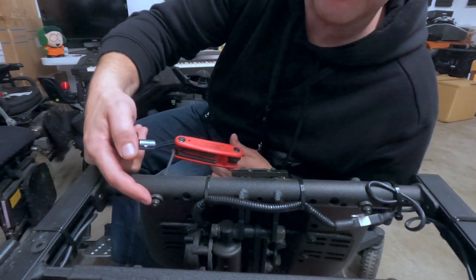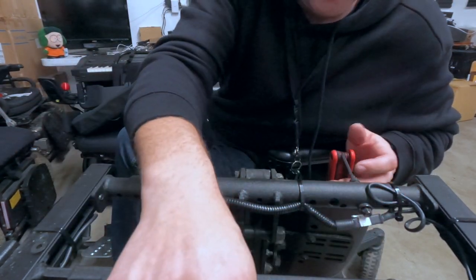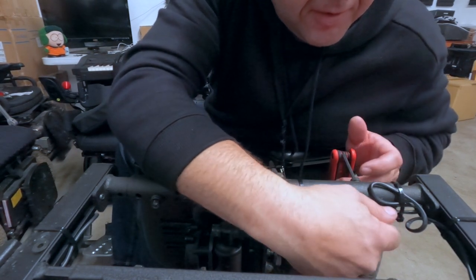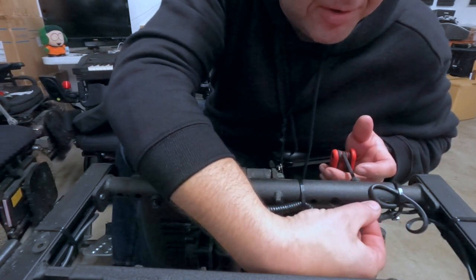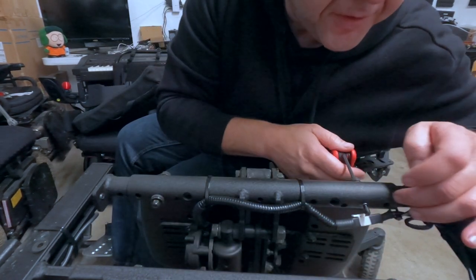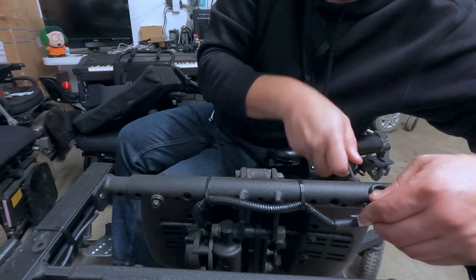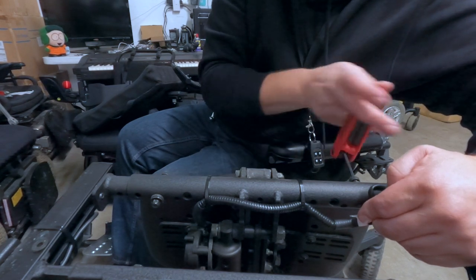Two pieces — yep, there we go. Here are two more adjustments up here. They've got an interesting stack of washers going on. If I remember correctly, Invacare uses these little things that kind of look like lock washers as spacers in here, so when you pull these bolts out you've got to be super careful because those might fall out and go somewhere. Let's see if that's the case here.